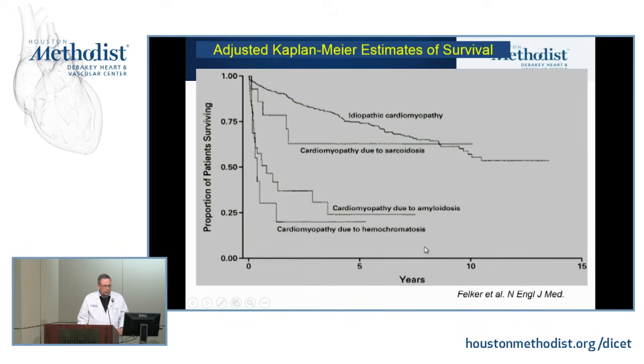And nowadays, again, more and more, we are depending on MRI. And I leave you with this last slide, which I'm sure Dipan might show too, because it's an introduction to him.